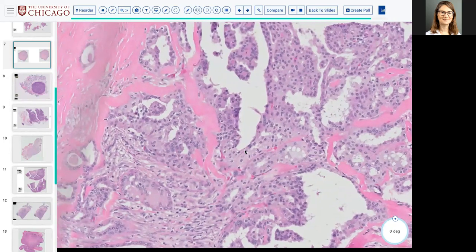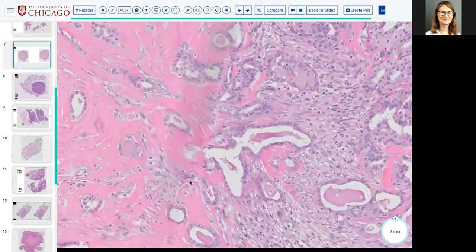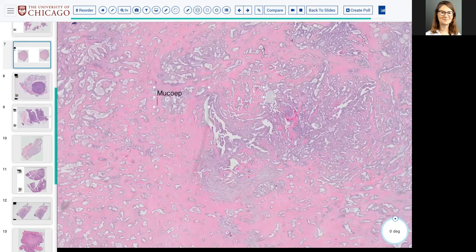Okay, S100. I mean, the molecular would also help, I suppose. Yeah. Mammoglobin. Mammoglobin would help. Okay, so mucoep is going to have true intracellular mucin, right? Is going to have what immunomarker diffusely, generally positive in mucoeps that highlights the intermediate and the squamoid cells?